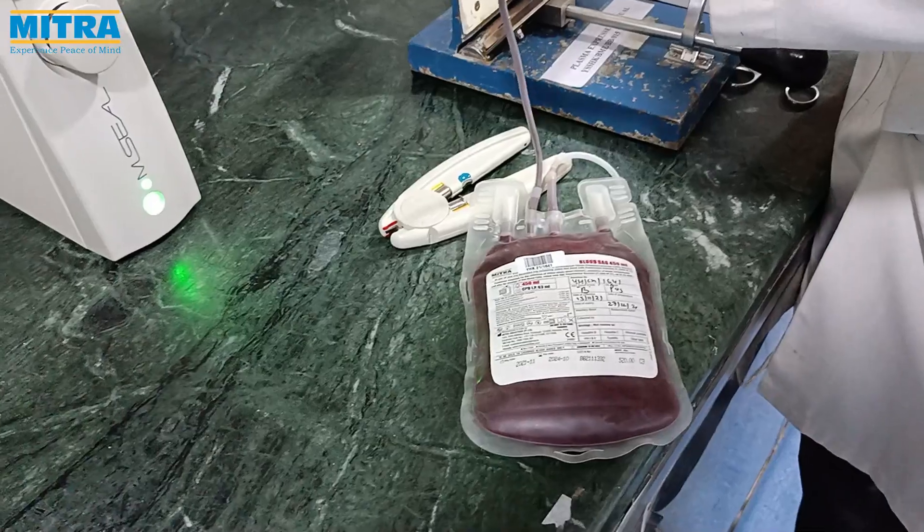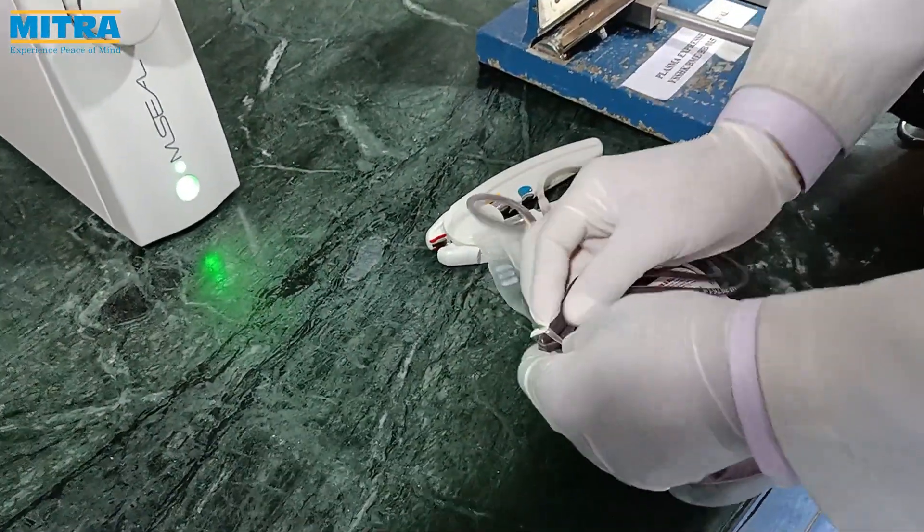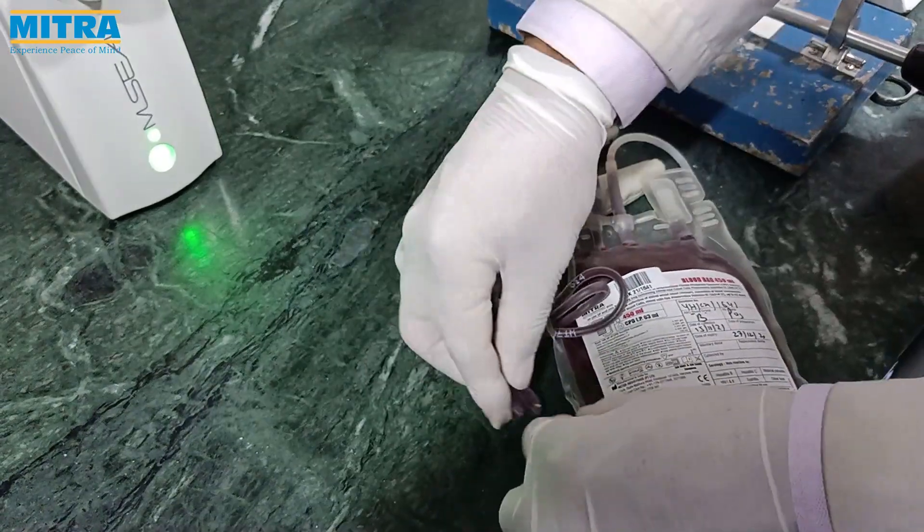After centrifugation, transfer the platelet-poor plasma into the plasma transfer bag; the platelets remain in the platelet transfer bag.